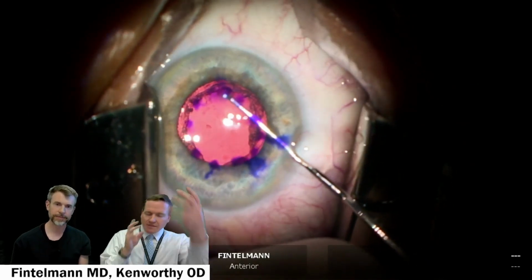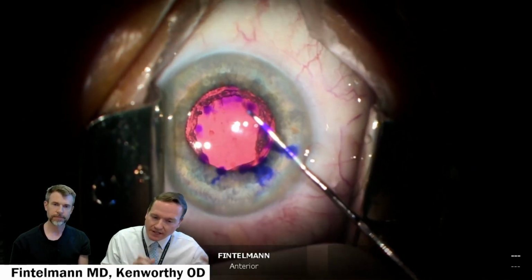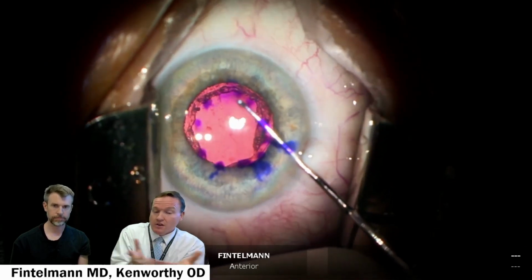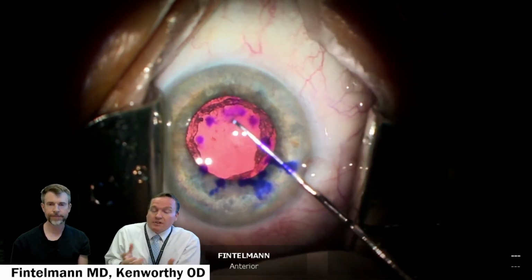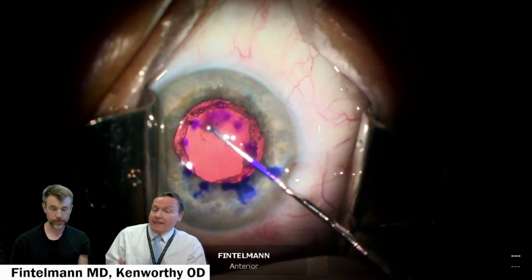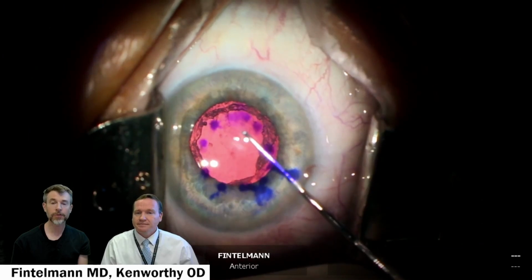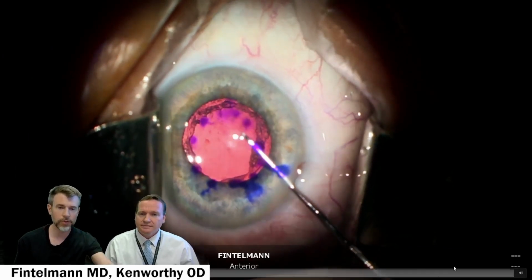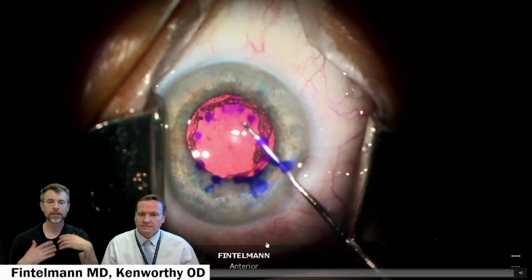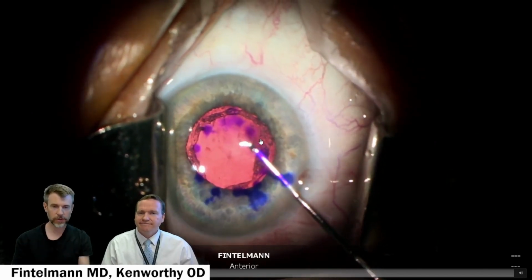And I think off the bat, I'm thinking of some advantages because we're going to look at a surgery where endothelium is removed and nothing is put back in its place. So on one hand, I'm saying, well, now there's nothing that can reject or really have a problem because you're not putting any new foreign tissue in there. And secondly, some parts of the world just don't have access to a lot of cornea banks and a lot of corneal tissue. Correct. And also as far as invasiveness, these are two small, maybe 1.2 millimeter incisions, so it's much less invasive. And also the manipulation is done in a closed space on the viscoelastic.